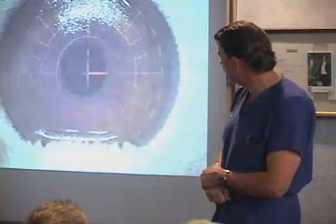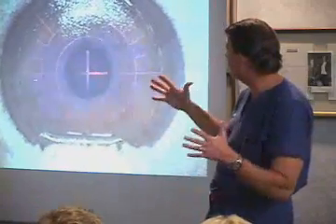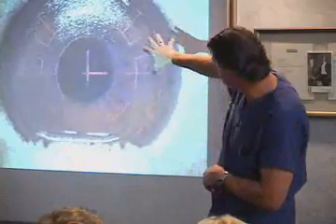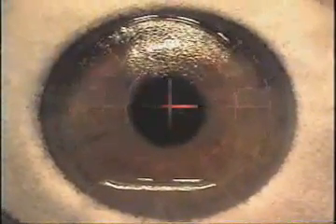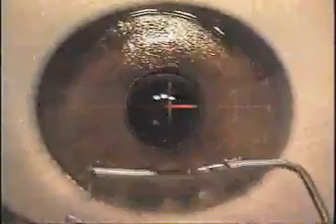In the last 15 seconds here, when we finally get down to it, we're going to do a blended large zone that'll be 8.5 millimeters. It'll be as big as the flap. It'll be bigger than his cornea. I think this is, there we go, we're blending. See, now there's many rotating spots of various sizes. And we're going to blend that treatment right out to the edge of the flap, so at night he'll have good vision. Okay. That's one of the advantages of a VisX laser. It's able to do that. Most lasers are not. Now I put a drop of fluid in the center, and it looks like a kaleidoscope to him. And then we'll float the flap back down. Wow.